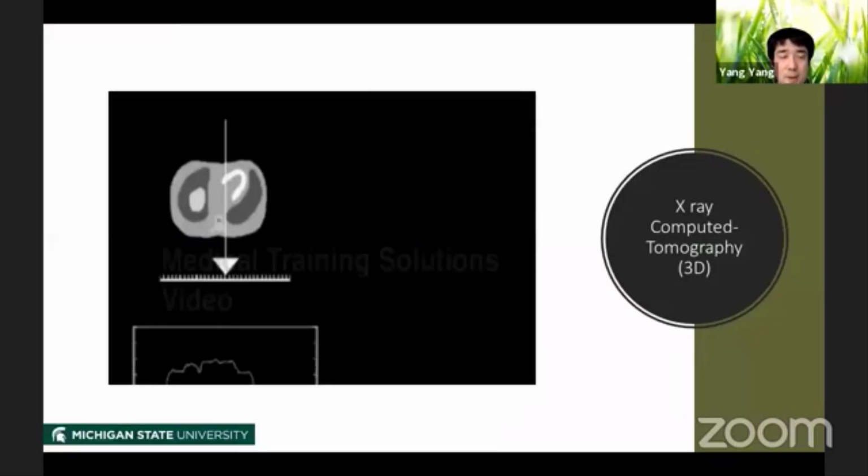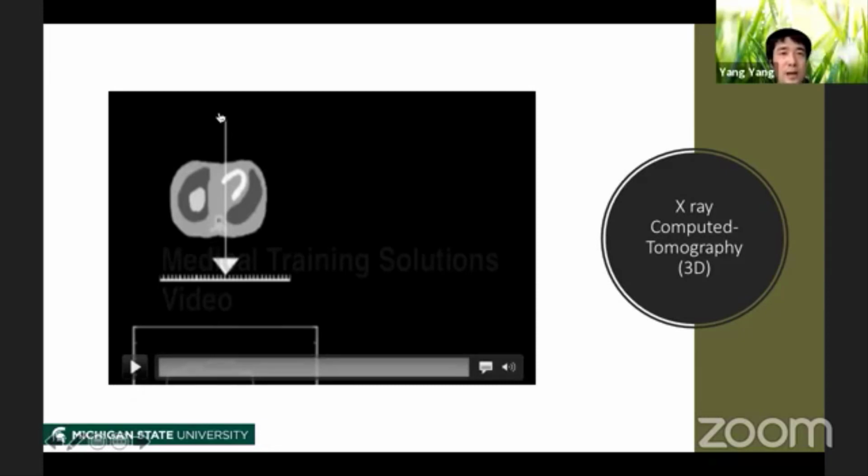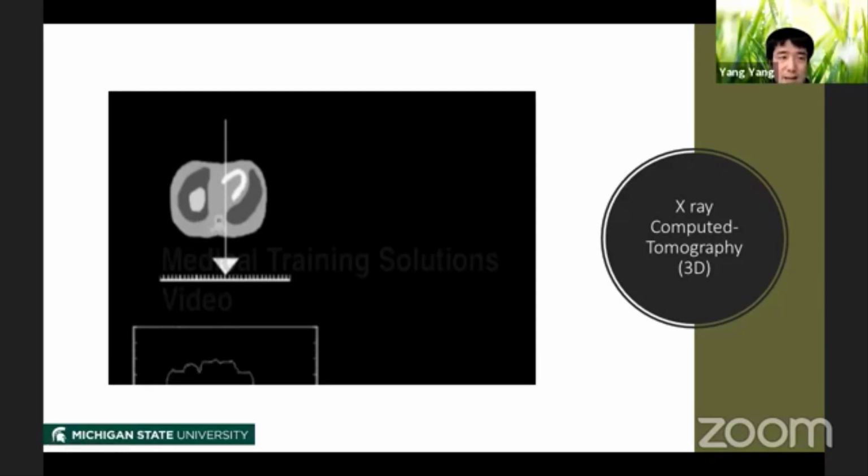And so there are very smart scientists who discovered ways to compensate for the loss of depth in using X-ray. Here is an illustration of the 2D X-ray. As we have seen before, we have an X-ray source on the top, and here is the human body that we would like to image. And on the other side, we have a photographic plate, which can collect the X-ray.